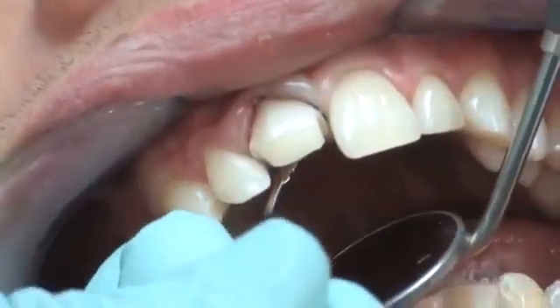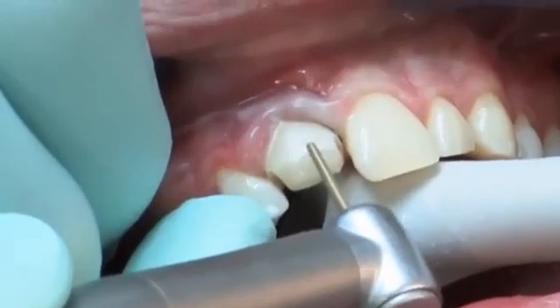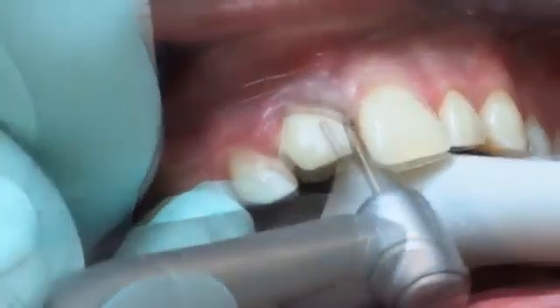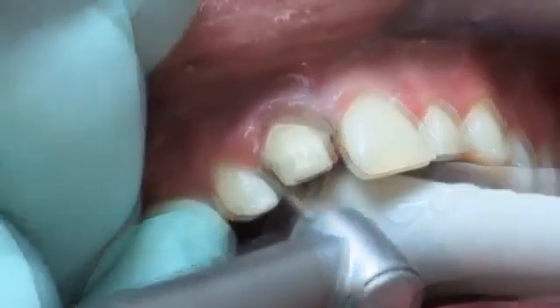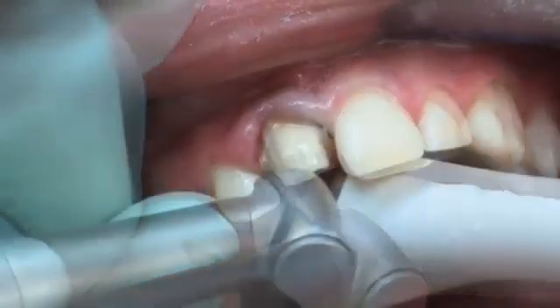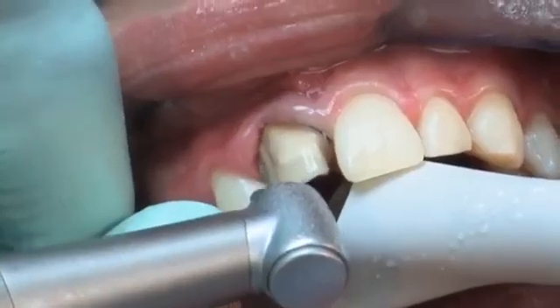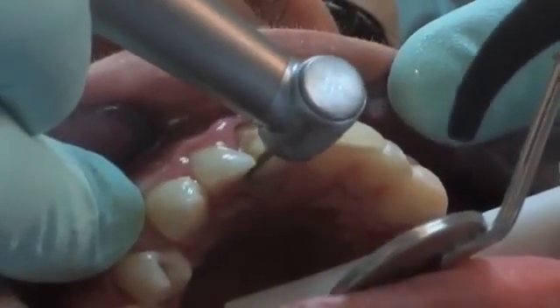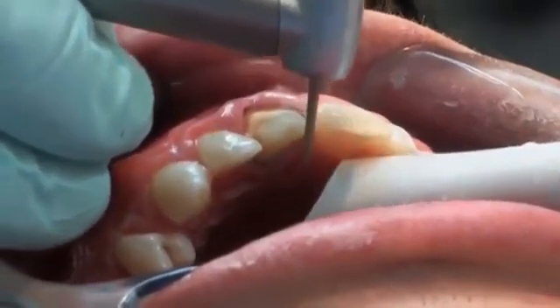A thin retraction cord is placed into the sulcus to protect the gingival tissue during the crown preparation. The preparation can now be performed effortlessly using a 40 micrometer diamond instrument. Due to the dentin-like hardness of Paracore, the transition between natural dentin and the core build-up is hardly noticeable during the preparation.